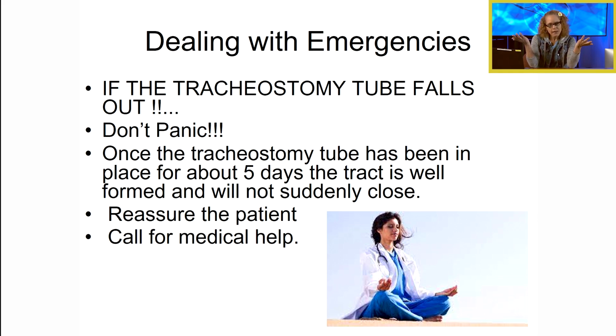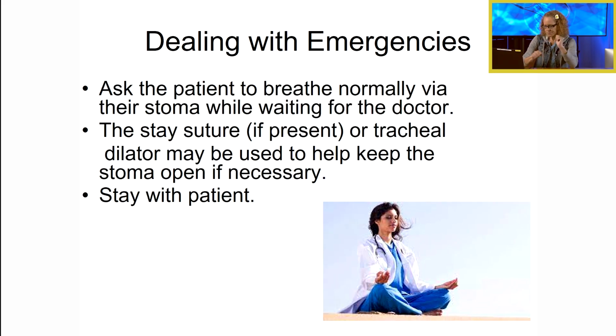No, not necessarily. So what I'm telling you is that if it's a new trach, relatively fresh, and it comes out, you really have to monitor the patient very carefully, call for medical help, and get that thing back in there, all right? If the trach has been in for many, many years, clearly, you're probably going to be okay, all right? It's important to know these things.